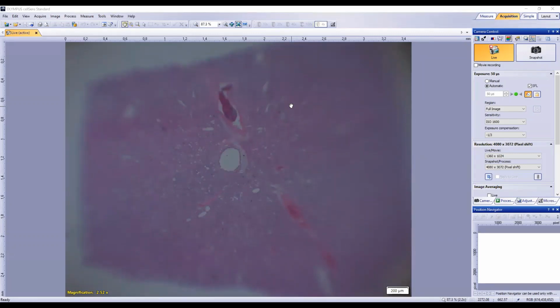Well, to me, it kind of looks like where the bronchioles and the airways are, it almost looks like it's forming a portal triad, a lobular pattern. So it does look quite like liver, especially with the density of the tissue around it. So this part up here where we've possibly got a large portal artery or something like that, and then a large portal vein underneath. Yeah, I can totally see that. Absolutely. The fisheye view makes things go fuzzy around the edges a little bit, but absolutely.